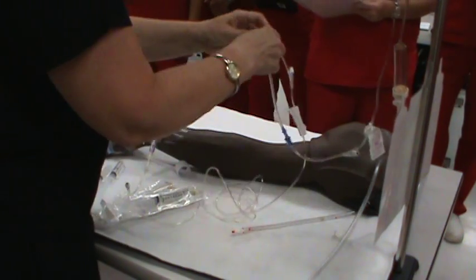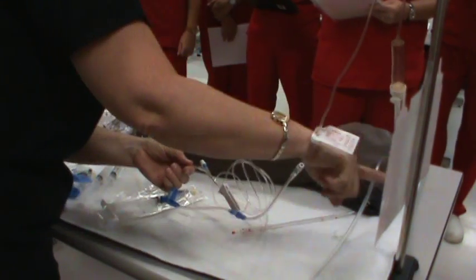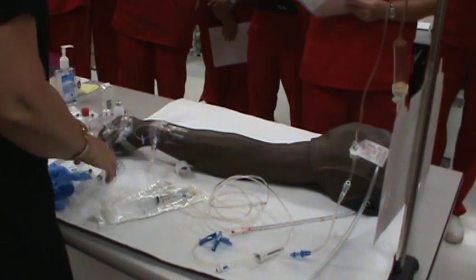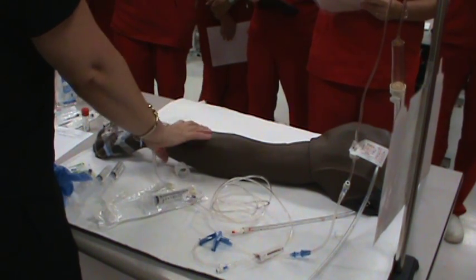So then follow your line all the way up, unroll it, unclamp it, restart it and go again. And just watch your patient for redness, swelling, tenderness, pain, it hurts.